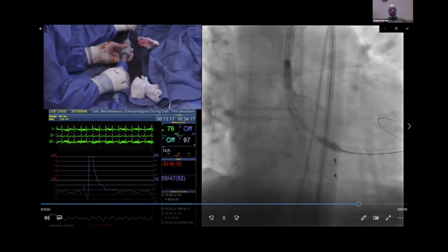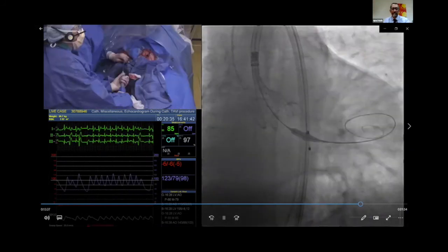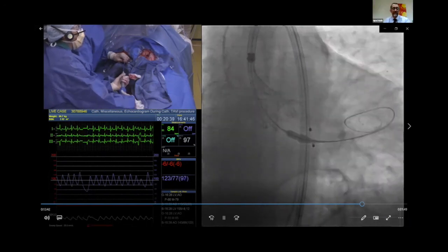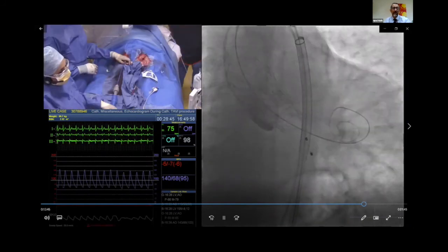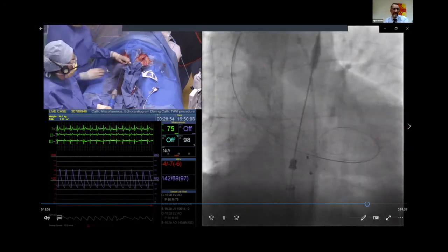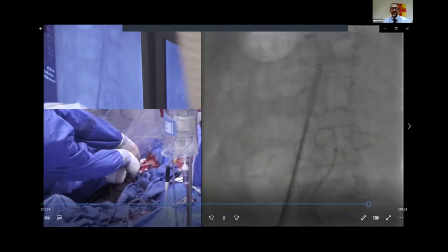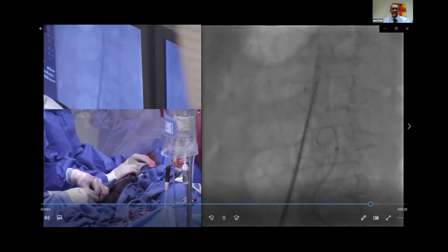So this is just a standard part of the TAVI procedure now. We're assessing the... Well, you keep that pigtail in place. So again, people vary. I must say I've never managed to trap a pigtail so that I couldn't pull it out. Once I do, I'll probably start pulling it back at this moment. But it's quite useful to have it in position, to know exactly where you're deploying it all the way. And I think if you've got a very tight sinus, you might choose to pull it back. But I must say I never routinely pull that pigtail back, either with Edwards or with the Evolut.